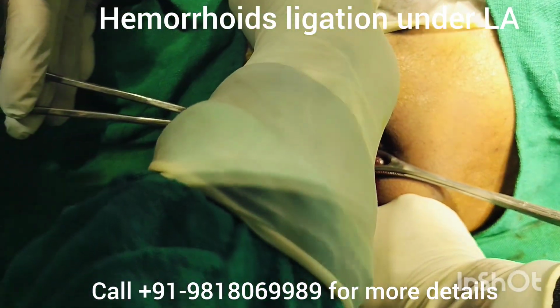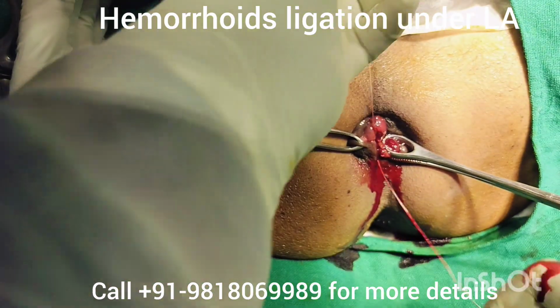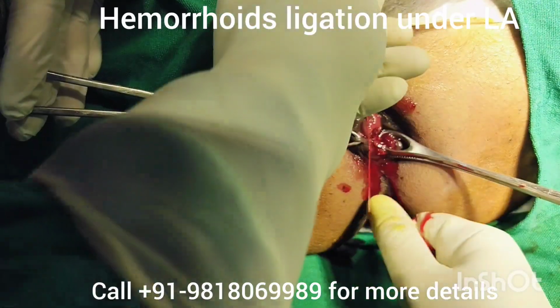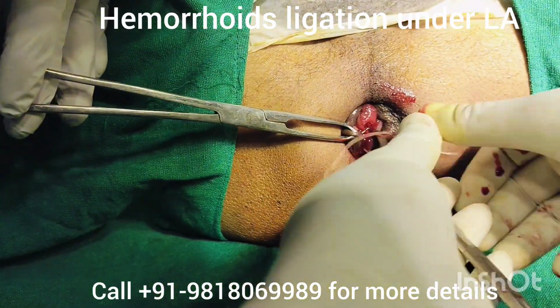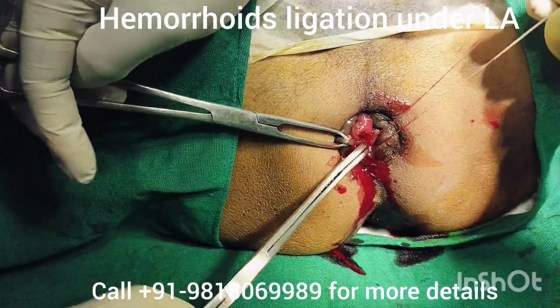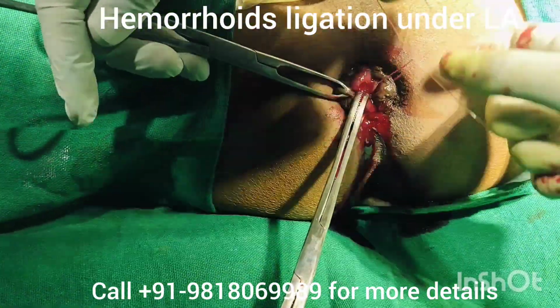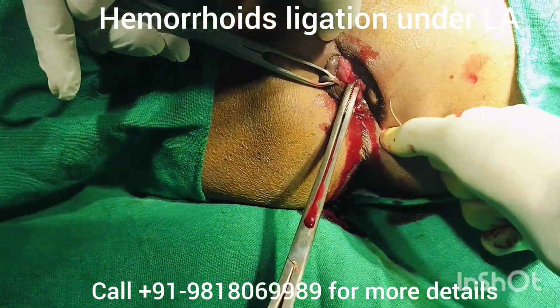If we don't make this groove, it takes much more time to shed off these pile mass. Now lateral knot has been placed. Now one or two more knots I will place to secure it properly.